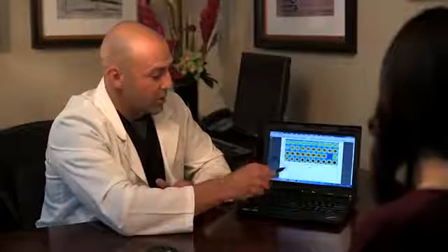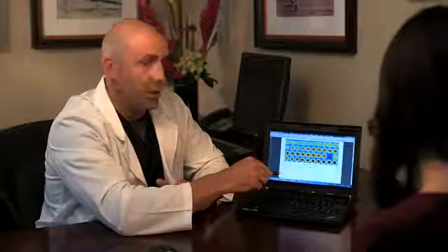Now, when we look at these measurements here, I see that your tears are evaporating at a very quick rate, and that's causing some blurry vision. I don't want you to worry about that because that's something we can easily treat by adding more moisture to your eyes. One way we do that is by utilizing artificial tears, which I have here, and you can put these in your eyes 4 times a day. That's going to add more moisture to your eyes and help stabilize your vision. So not only will it help your tear film, but it will improve your quality of vision at the same time, okay? Sounds good.